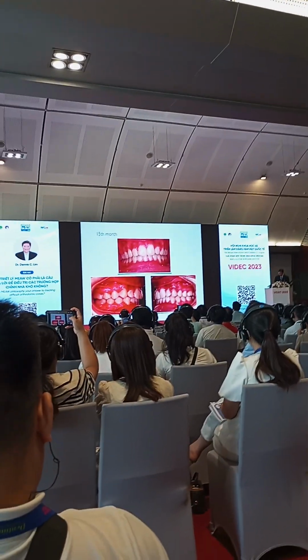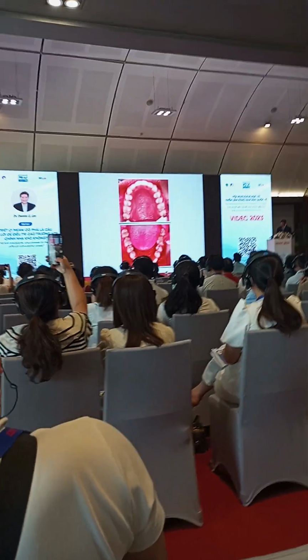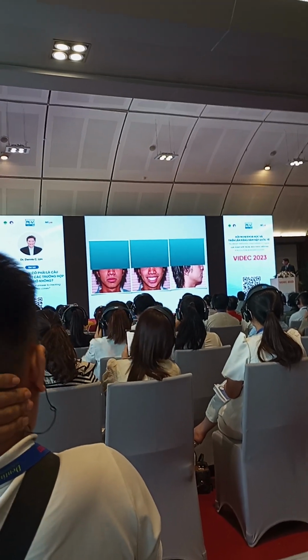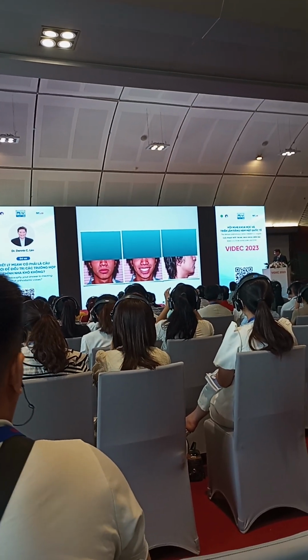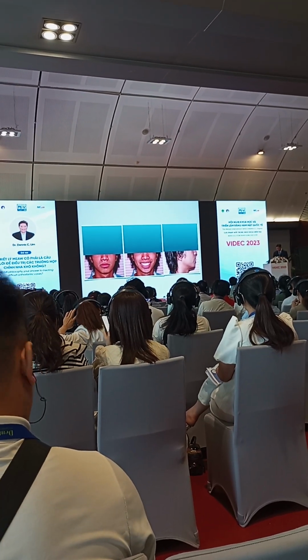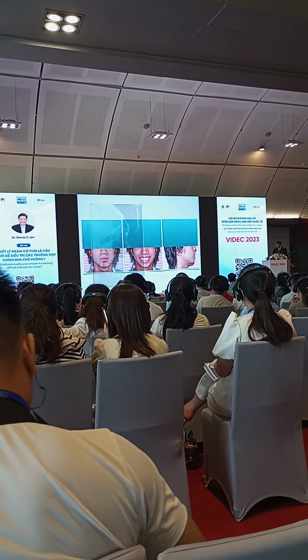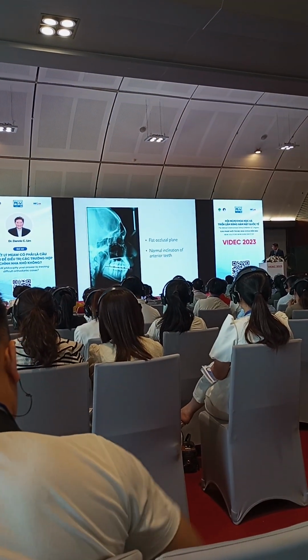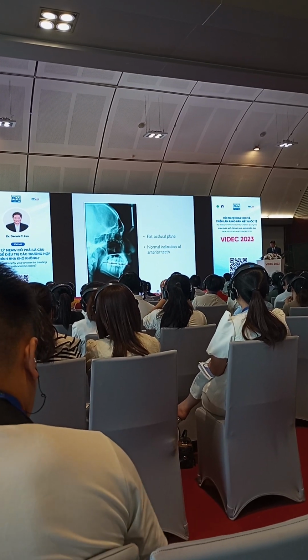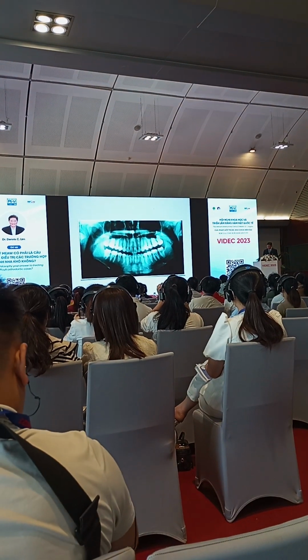So if you try to look, this is an occlusal view. So this is now the face of the patient. You still maintain a good straight profile. You increase the vertical dimension of the patient. This is the set. You're able to flatten now the occlusal plane. This is the panoramic.